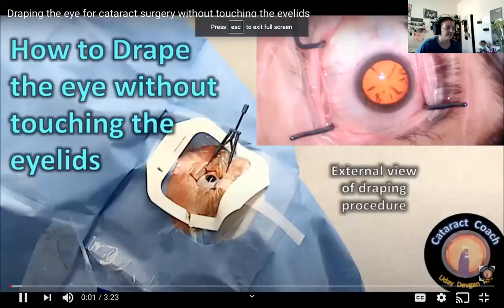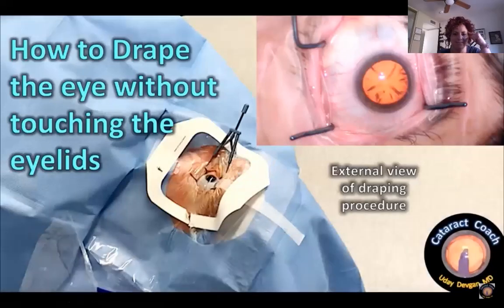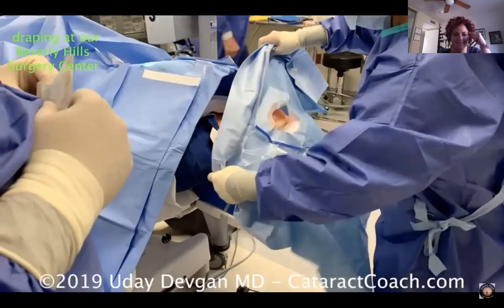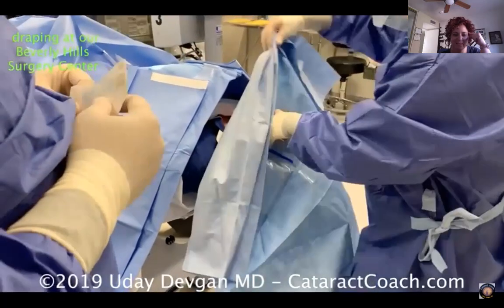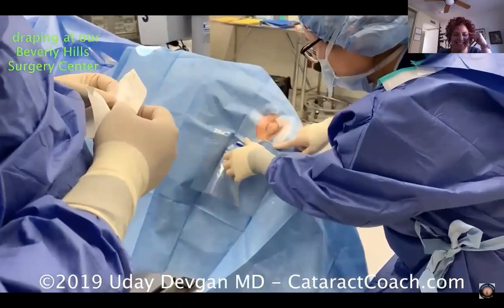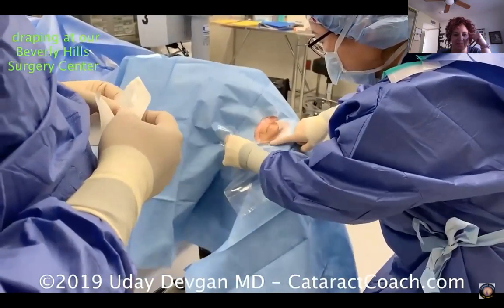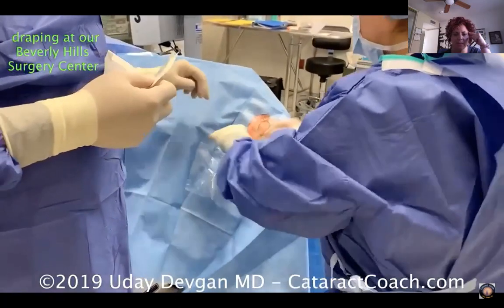CataractCoach.com. How to drape the eye without touching the eyelids for cataract surgery. Let me show you my technique. Here's how we do it at our Beverly Hills Surgery Center. We place this first drape. It has a cutout for the eye, and it's adhesive. And that sticks around the face, has a nice seal, and the eyelids are now exposed. We don't touch the eyelids. We're just touching the drape. No touchy.